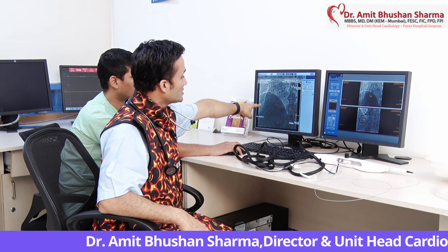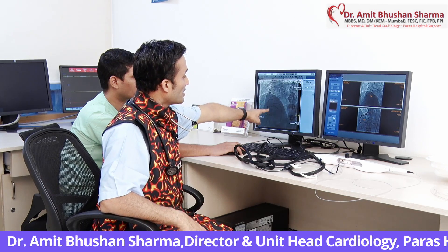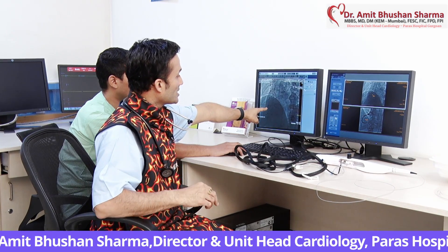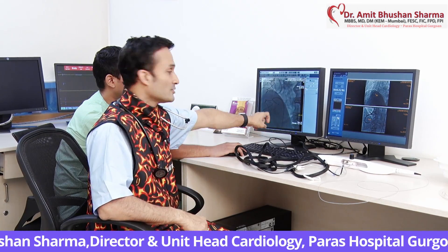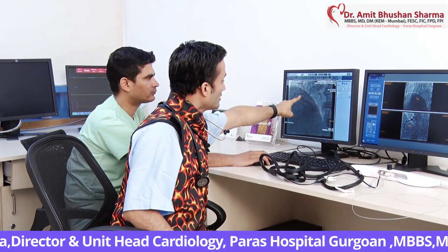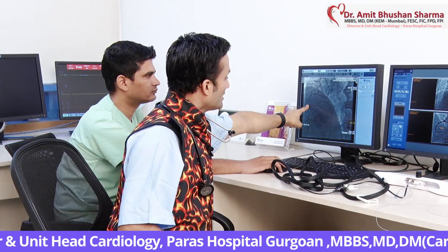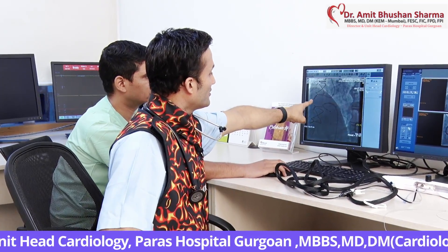Multiple balloons and multiple hardware were used. Once the CTO wire was crossed, the rotabar was advanced. The rotabar works very much like a dentist using a dental drill. If you see carefully, this is how the dental bar goes — it goes all the way, breaks the calcium, drills further down, and breaks the calcium further down. Once the calcium is broken, there is enough space for the balloon or the stent to go.